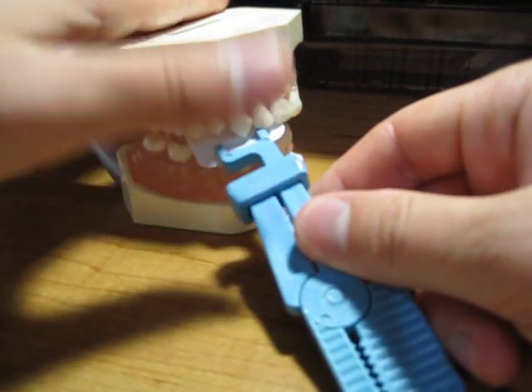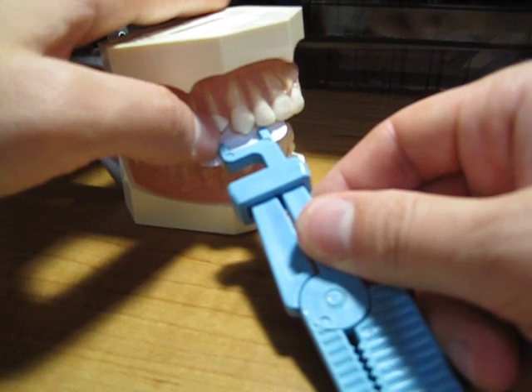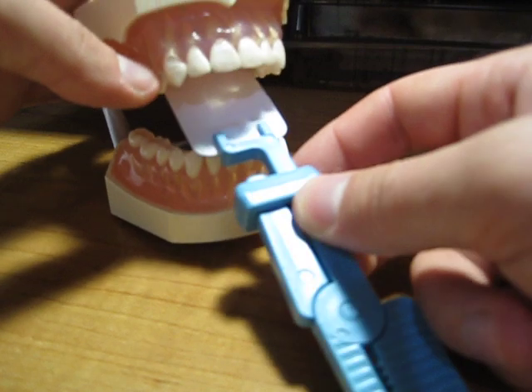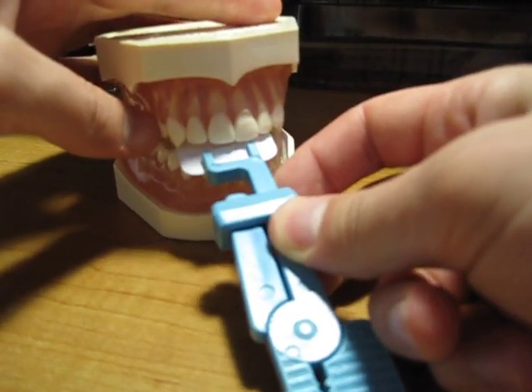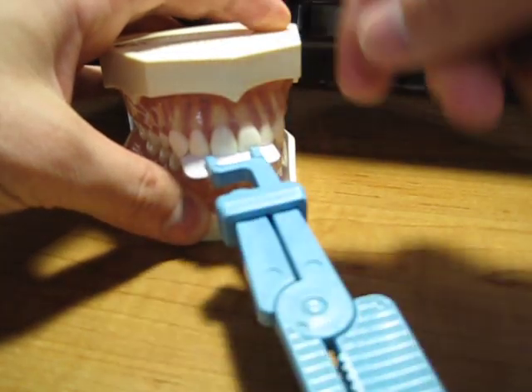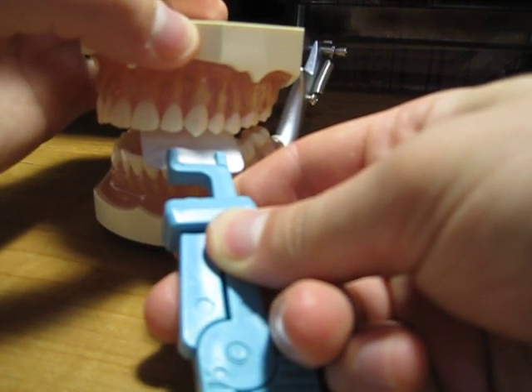Now usually we won't use the snap array for the anterior, because we have a better way of using the paralleling technique with the XCPs. But if we had to, this is what we would do. For the centrals, you would just center it on the centrals like this, and the x-ray would come down at the right angle. Then for this canine right here, it would go right there.